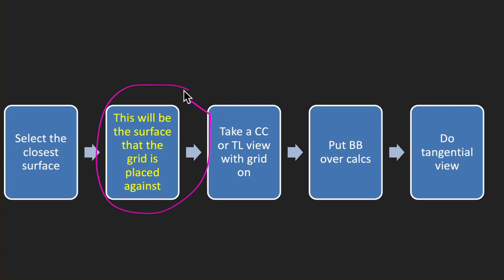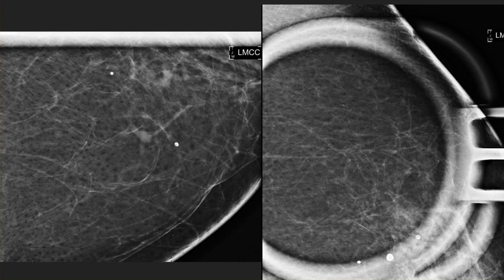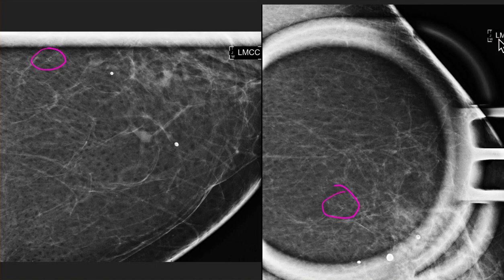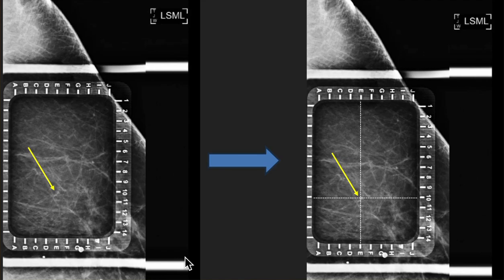You're going to take an image and then place a BB over the calcs. Coming back to these calcs — they're up here and almost invisible on the true lateral view. We decided, looking at all our different views, that we thought they were closest to the medial surface of the breast. So we have the patient set up with a medial-lateral: the grid against the medial surface and the image receptor against the lateral surface of the breast. And here are our calcs.